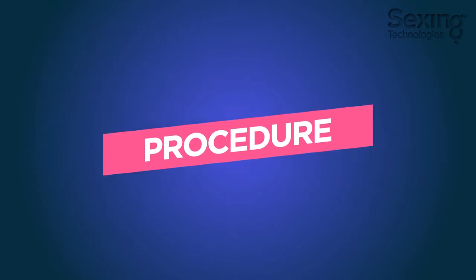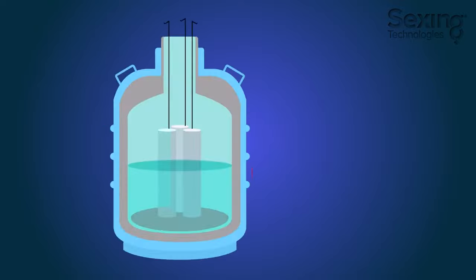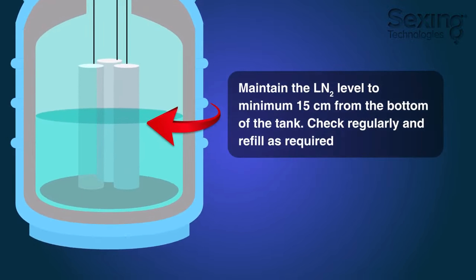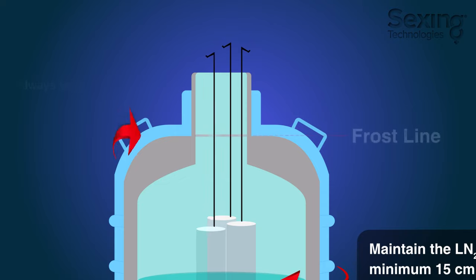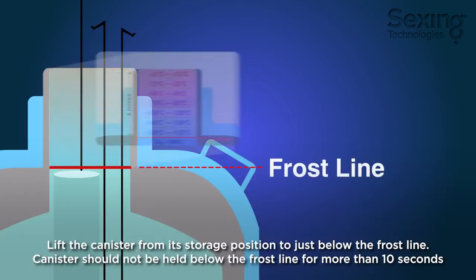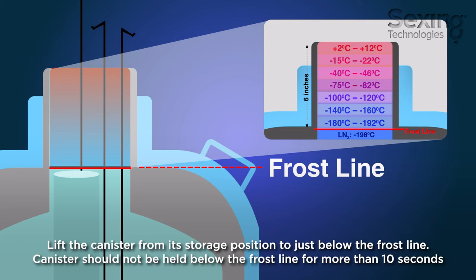Semen handling procedure. Always maintain the liquid nitrogen level at a minimum of 15 centimeters from the bottom of the tank. Check the level regularly and refill as required. Lift the canister from its storage position to just below the frost line. The canister should not be held below the frost line for more than 10 seconds.